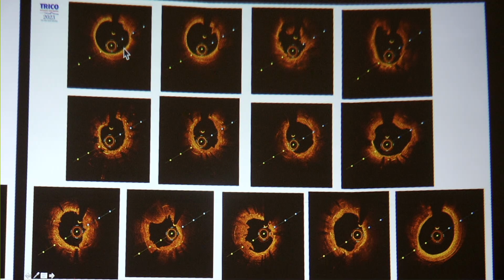a good amount of healthy tissue seen here, except for the 12 to 3 o'clock position with some degree of calcification. And by the third image, you can see the evidence of plaque rupture. Dense plates of calcium are seen in this image, and 2 layers of stent are very well evident in the middle row, with evidence of heterogeneous tissue distribution.